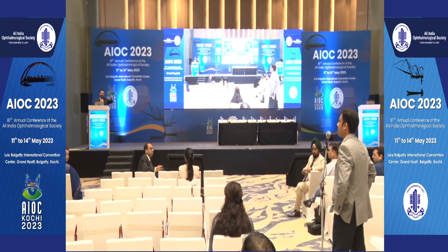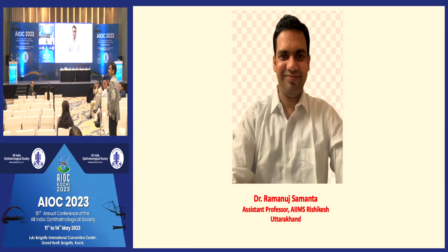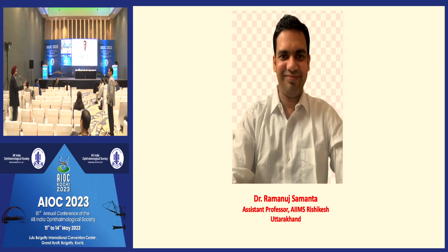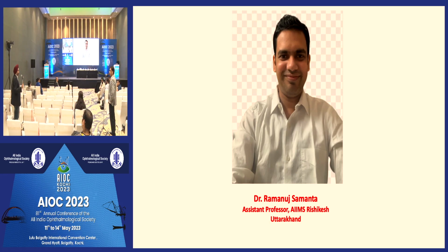And Ramanuj, after that, I'll request you to also come for your talk, please. You can milk it with your diamond dusted scraper. You can milk it towards the break, but it does not go there easily. If it is not going there, you can make a retinotomy over it and you can take it out. Making it superiorly is better, but you can always milk it through that retinotomy. Once it's held with the suction, it will not go away.